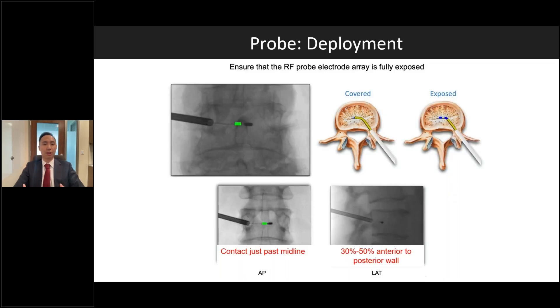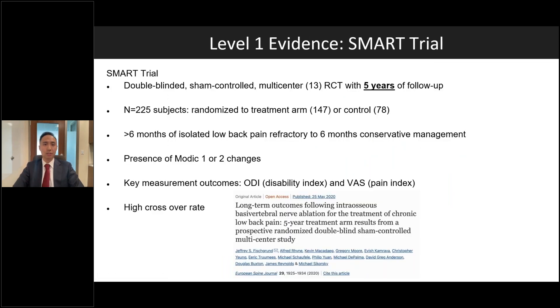When deploying the RFA probe electrode, ensure the tip is past the midline because the active section of the electrode is just proximal to the tip. In the AP view, the tip should be past midline. In the lateral view, aim for 30–50% anterior to the posterior wall for lumbar levels, and about 50% anterior to the posterior wall for the sacral level.